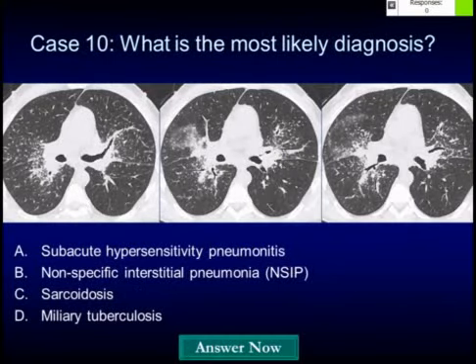All right, the next case. Go ahead and vote.